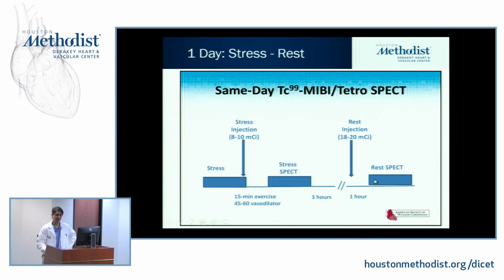This is completely reversed if you were to do stress first. As you know, this is the protocol we use in our lab here. So we're stressing first at the lower dose, waiting 3 hours in between the stress and rest studies, and then giving a higher dose rest injection.